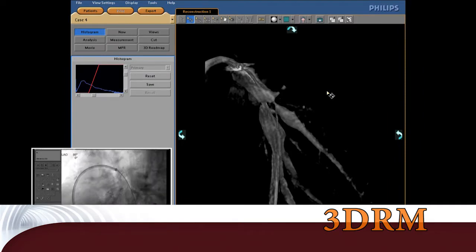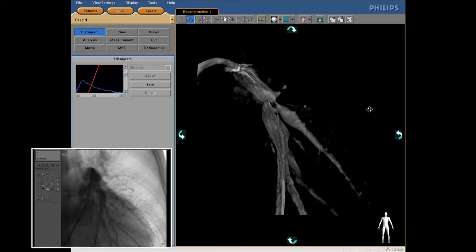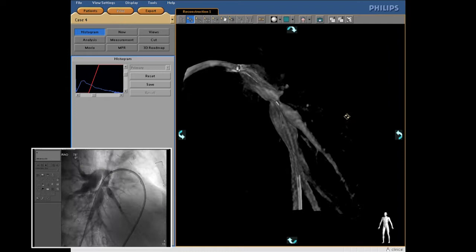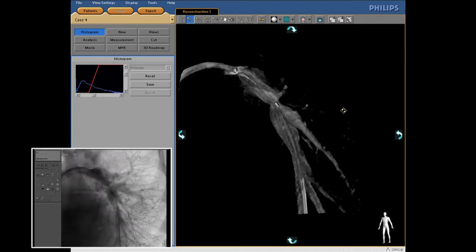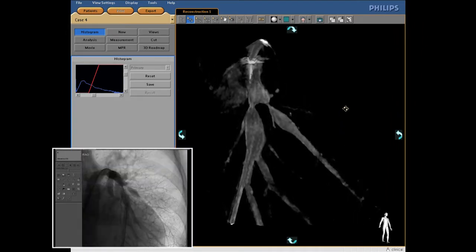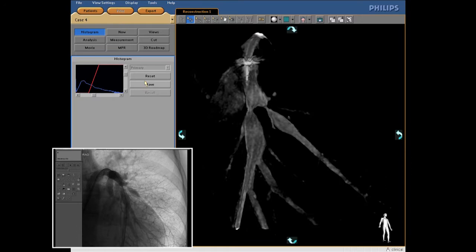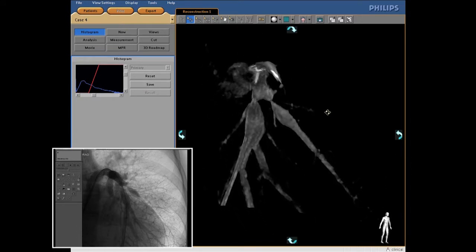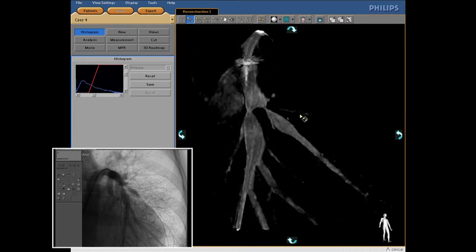Can you see the 3D roadmap? We can rotate it and simulate to find out the most stenotic vessel clearly. We try different angles — caudal is better than cranial in this case. So we rotate the simulation to find out the most optimal imaging angle. On the left side we have another stenotic region. Angle one is better.